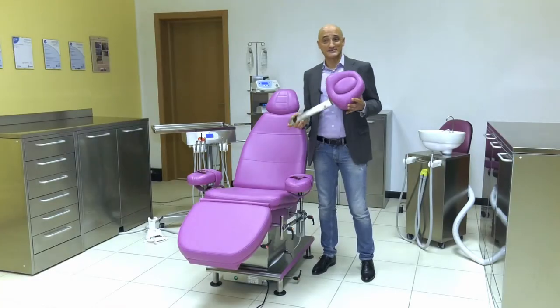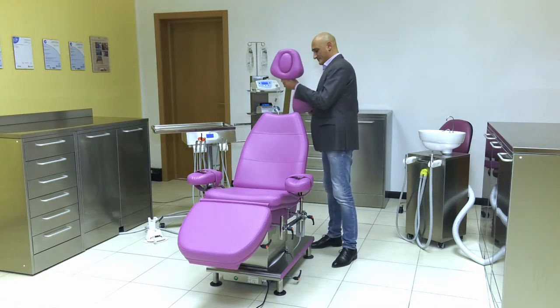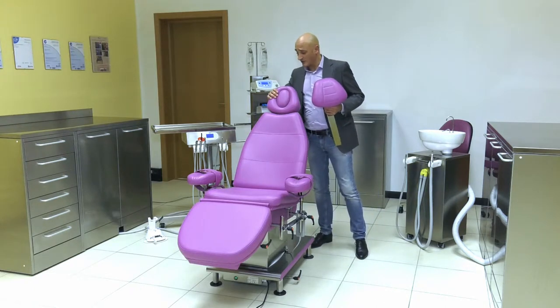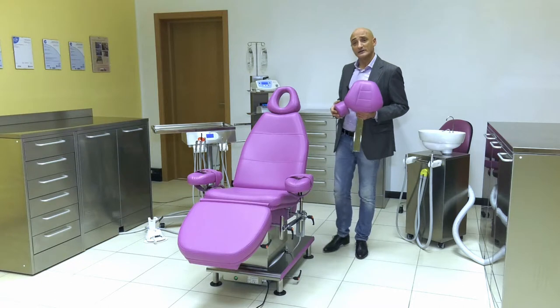We also have an optional headrest that is easy to change. Why did we make this headrest? Because it has an oval insert. When I remove it, I have an open space, allowing the patient to lie flat when the chair is fully extended.